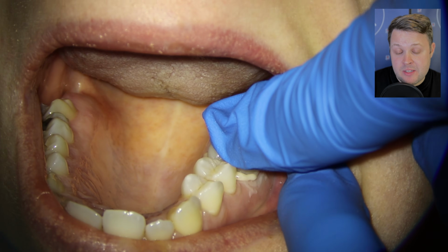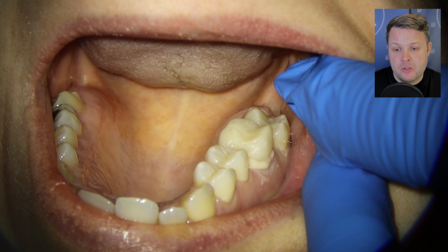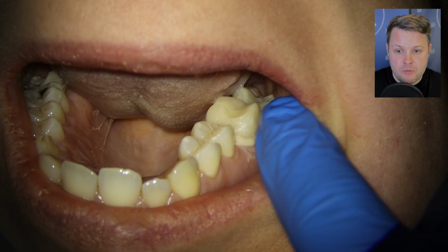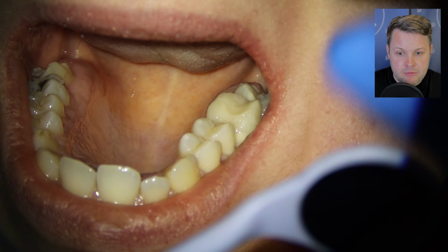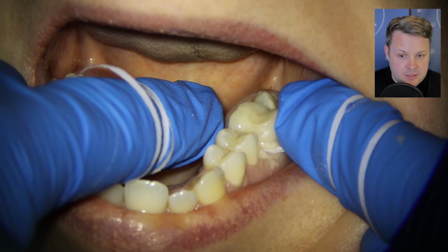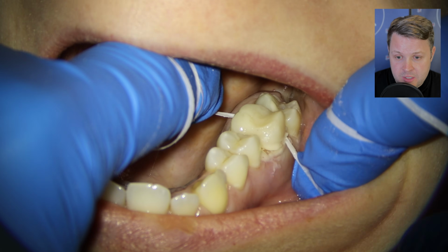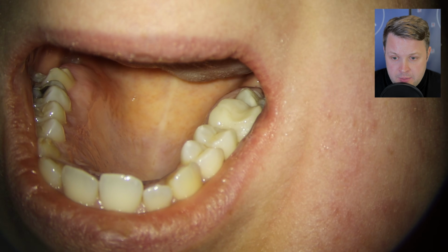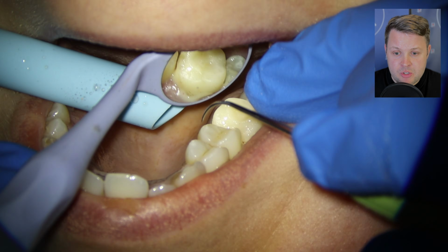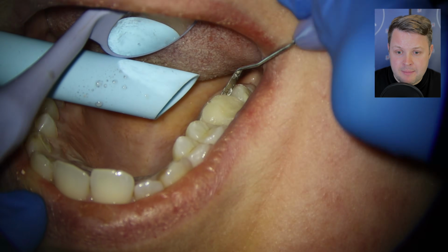It's not an exact science with these sorts of things, but what I notice is that once you've put the temporary on and improved the margins, when you come to do your final restoration, the gum settles down and it's not as red and sore, and it's easier for you to get that margin. Difficulty with margins like this, of course, is if you're doing scanning, it's a tough one to manage. But we're just using these tiny little composite moulding instruments to sort the edges out, and they don't look fantastic, but overall I'm quite happy.